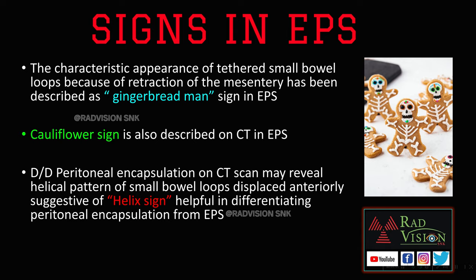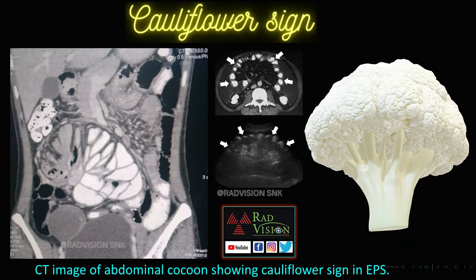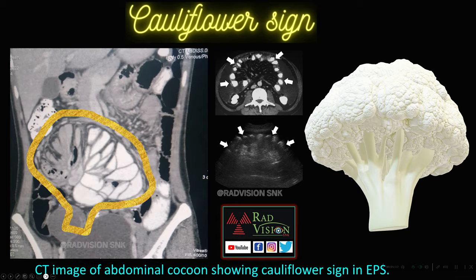When there is clustering of bowel loops surrounded by a fibrocollagenous membrane, it mimics a cauliflower. On CT, multiple bowel loops are attached to the mesentery by a narrow base, and on ultrasound, the same multiple bowel loops attached to the mesentery mimic the cauliflower sign in EPS.